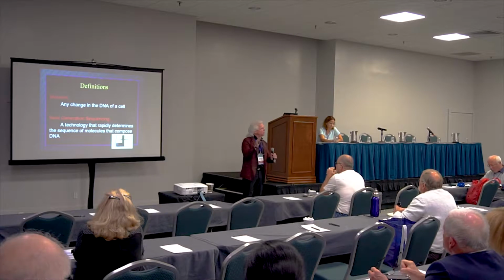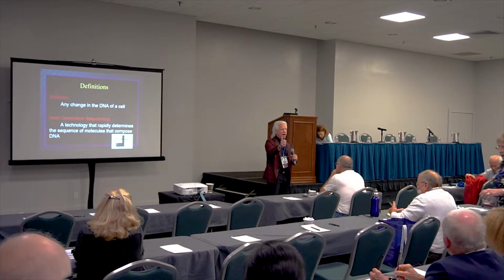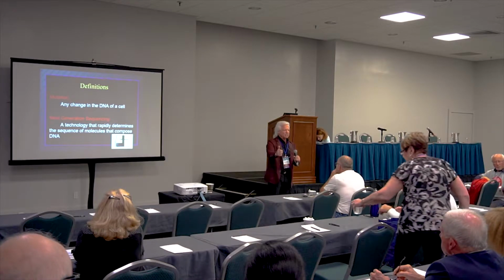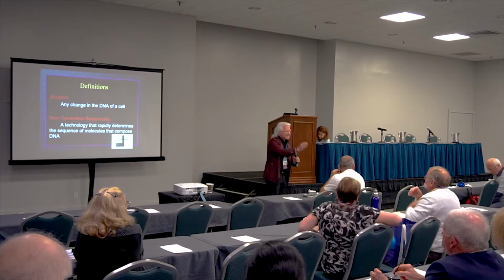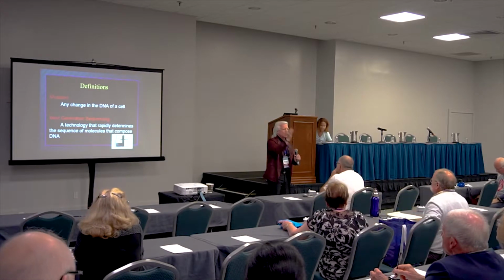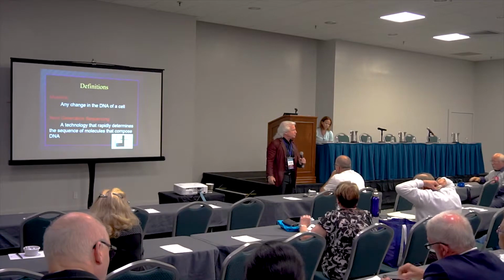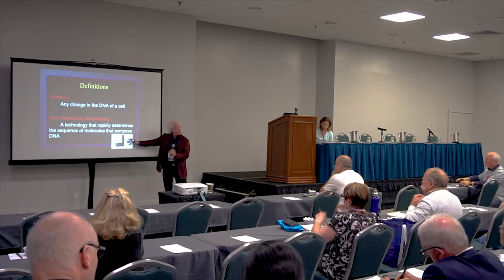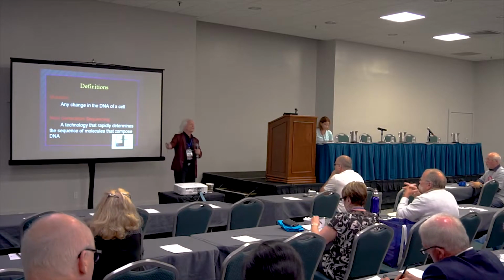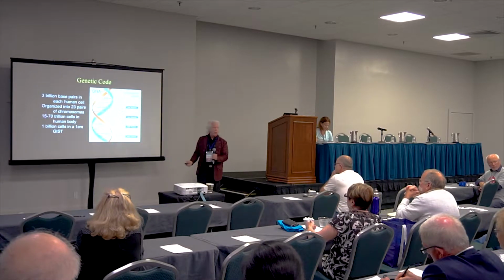Well, next generation sequencing is a type of technology that's extremely sophisticated, extremely powerful, that assesses every little molecule in the DNA to determine whether or not there's a mutation. And this is the type of equipment that performs the next generation sequencing.